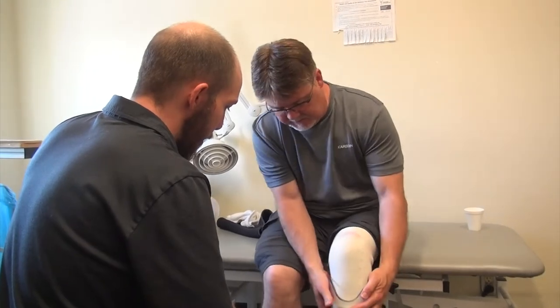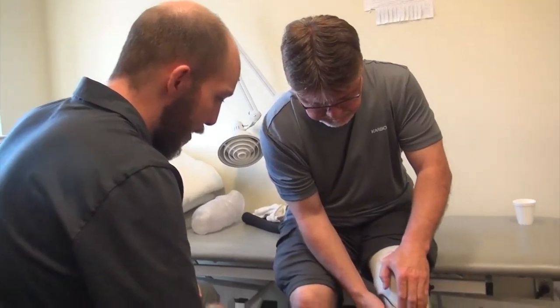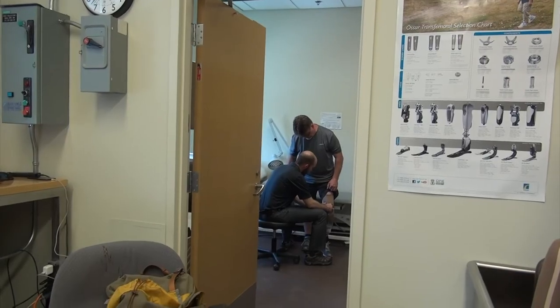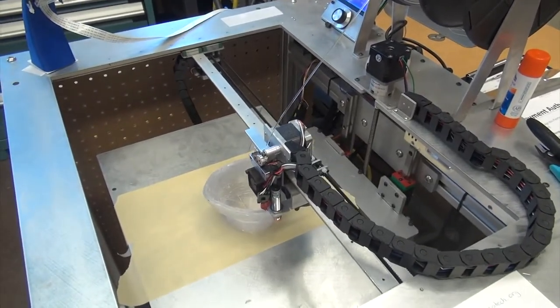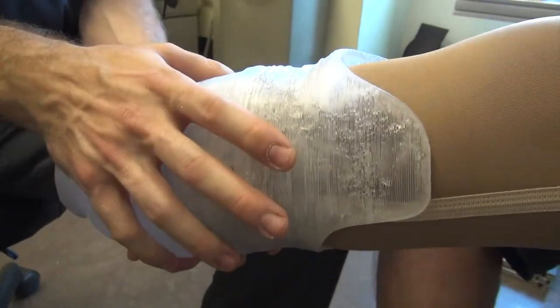Sean Fitzpatrick became an amputee following a motorcycle collision last year. He says the traditional manual casting method has its drawbacks. It's a whole week before you get it, and a whole week might not seem much, but for somebody that's learned how to walk and everything, it's pretty significant. He says it would be great for patients to have another option — 3D printing scans your whole leg, that's your leg, and hopefully it slides on and fits like a glove.